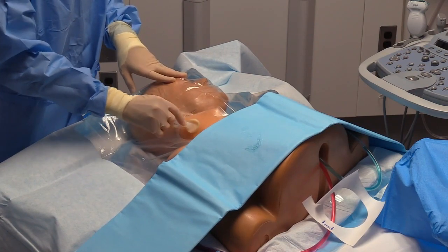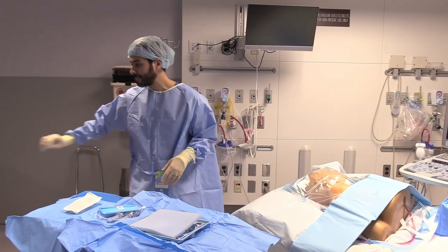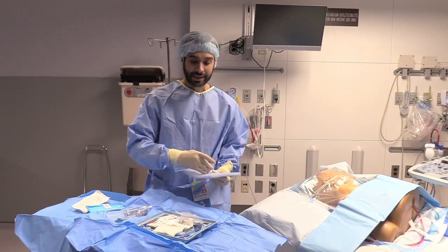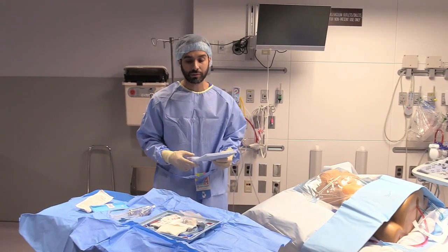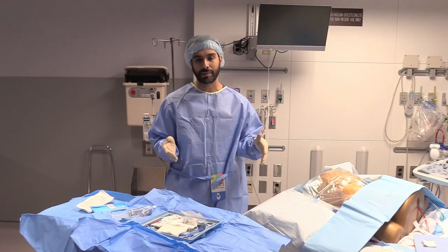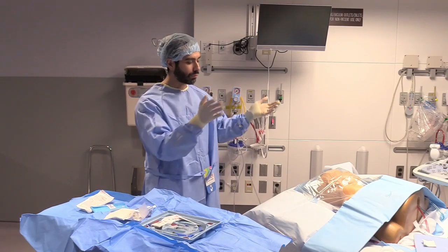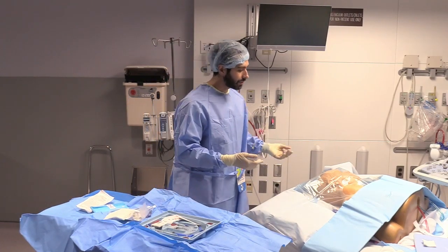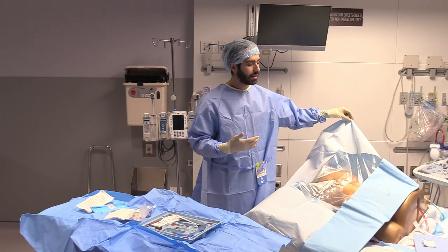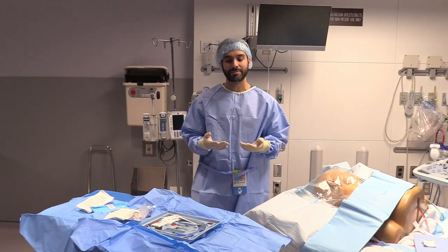So now that the neck is prepped, clean, and there's a sterile drape and you're clean at this point, you're ready to start with your line. I usually would have prepped my catheter beforehand. I didn't do that in this situation, but usually I like to keep the patient underneath the drape for as short a period of time as possible. They get anxious underneath there. It's uncomfortable to have a plastic bag placed over your head this way. So if you have a nurse here, sometimes just giving them a little tent will make them feel comfortable, like they can breathe well. The other thing is to allow this to stay here for as limited a period of time as possible.